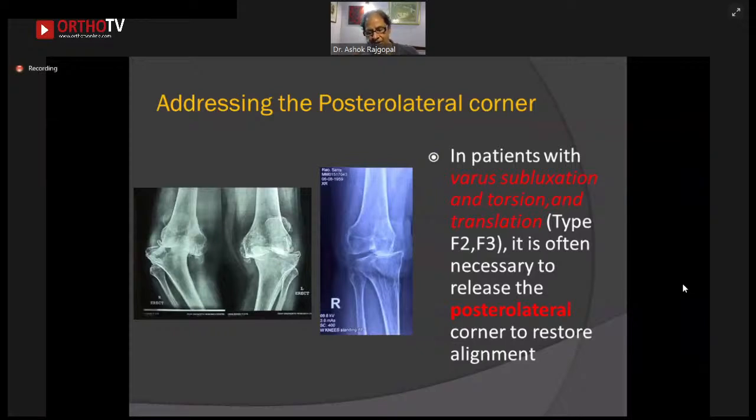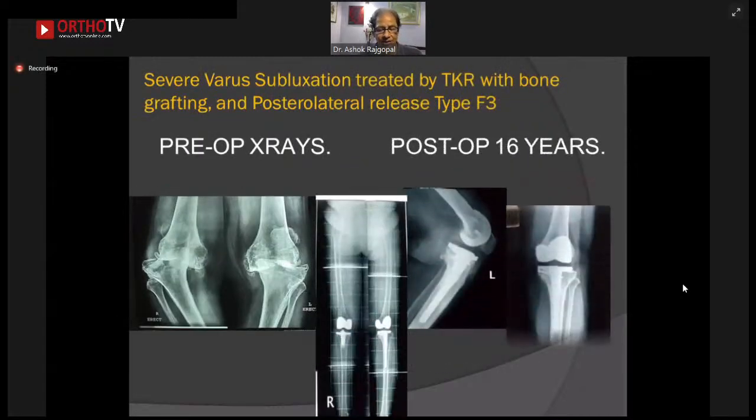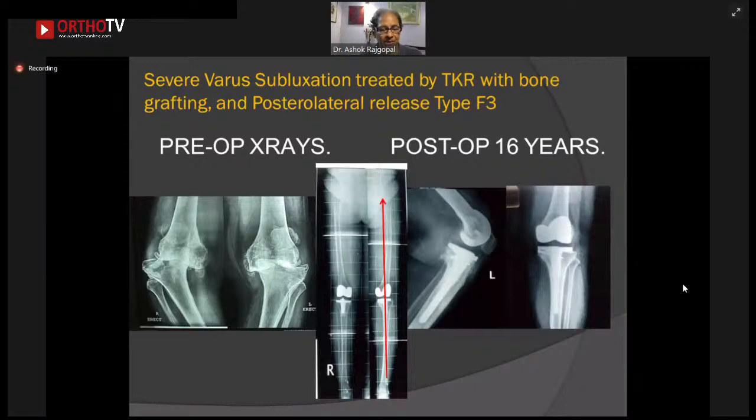And if you put your finger down the posterior lateral corner, just behind the popliteus tendon, you find a tight tether, tight corner. And this is the posterolateral tether that we have described in this article. And we release that.